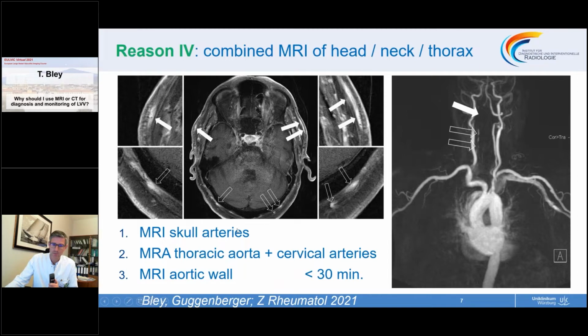So this is one of those cases Bhaskar already mentioned, that many arteries are inflamed at once. So in this case, certainly in our case, we would not use a biopsy to confirm the diagnosis. But if a biopsy was performed, I'm very convinced that both sides would render positive findings.